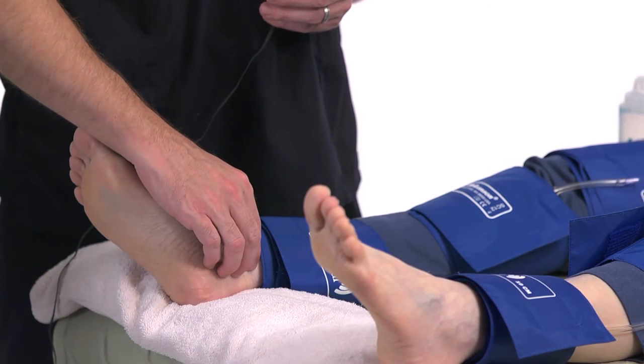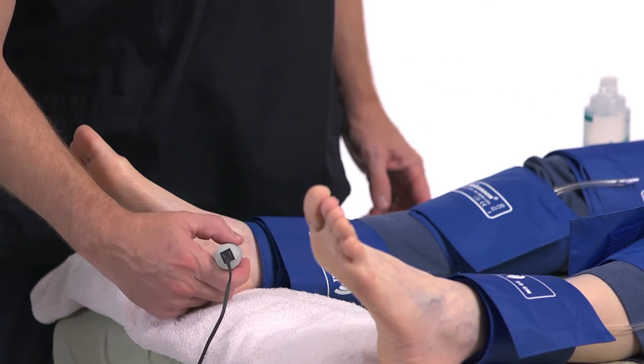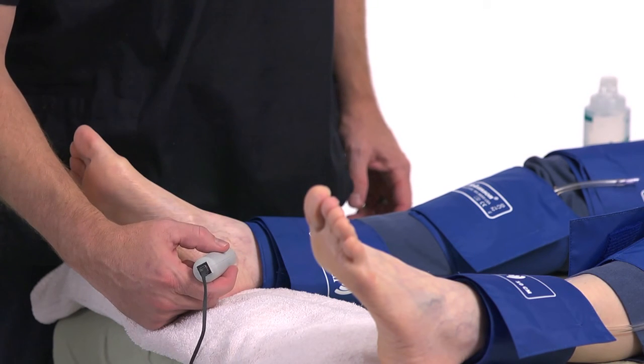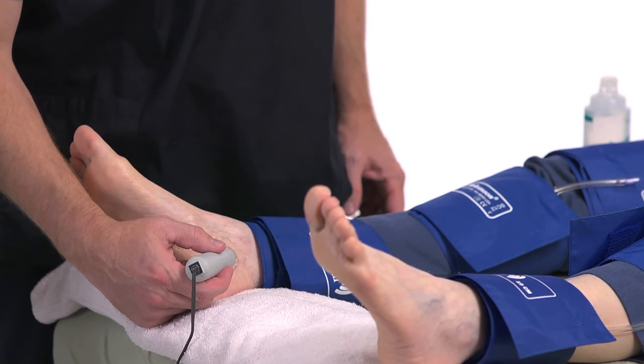For the posterior tibial, or PT, find the artery on the inside of the ankle. The PT is usually about a half an inch or so below and behind the ankle bone, about halfway between the ankle bone and the end of the Achilles tendon. Try to palpate the artery first.